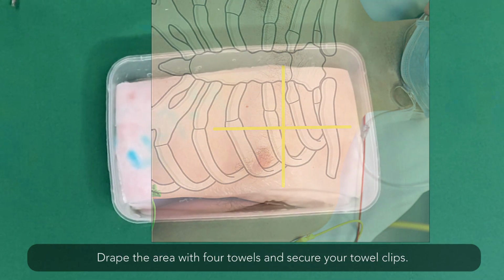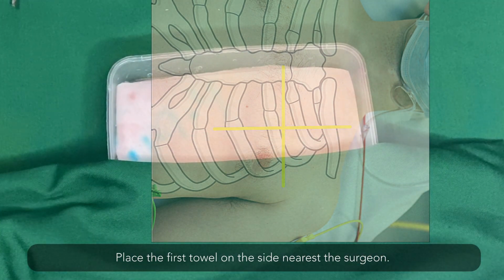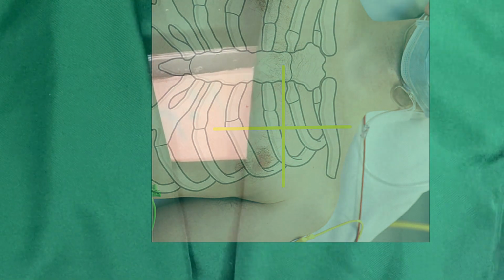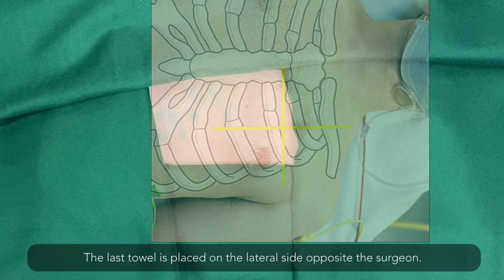Drape the area with 4 towels and secure your towel clips. Place the first towel on the side nearest the surgeon. Then place the towels in the cephalad and caudal positions. The last towel is placed on the lateral side opposite the surgeon.